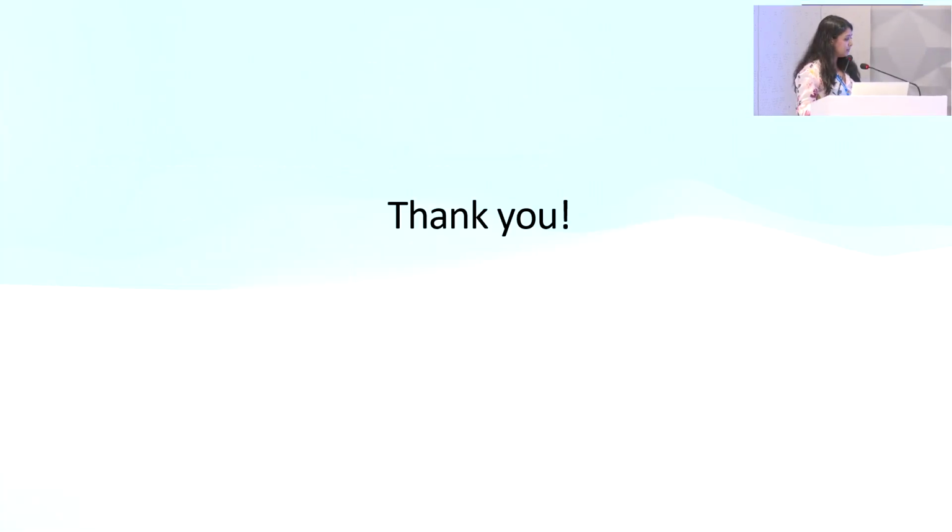Thank you. So, suppose you're sitting, you're doing the surgery, how do you identify whether you're putting it right or not? Ma'am, before injecting, the surgeon should... No. Suppose you've just forgotten. Then on the table, how do you identify? Ma'am, I can see that the vault is the most important thing. The vault remains downside. How would you ascertain that the vault is downside? Vault is convex.